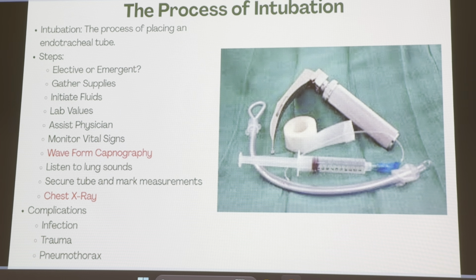Sometimes you may be assisting more at the head of the bed as well while the respiratory therapist is getting the ventilator set up. So if it's in an emergency situation and we don't have time to plan for these things, that respiratory therapist is going to set up the ventilator while you're bagging the patient, waiting for that anesthesia to kick in and making sure that patient's fully asleep and fully relaxed before he attempts to place an endotracheal tube.